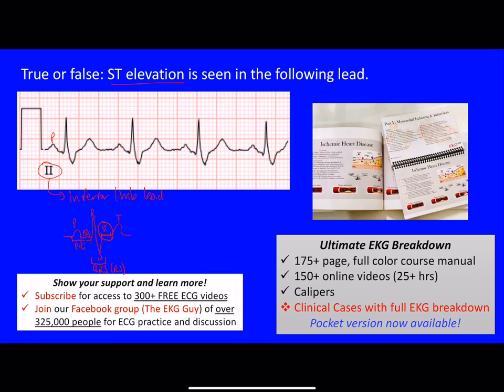We're asking about elevation of the ST segment, which is this portion here. Looking at our complexes on Lead 2, this is our ST segment — we'll highlight it right here. You can see how it's upsloping a little bit. Now, sometimes people will use the TP segment — here's the T wave, here's the P wave — as the baseline. More recently, we tend not to use that.